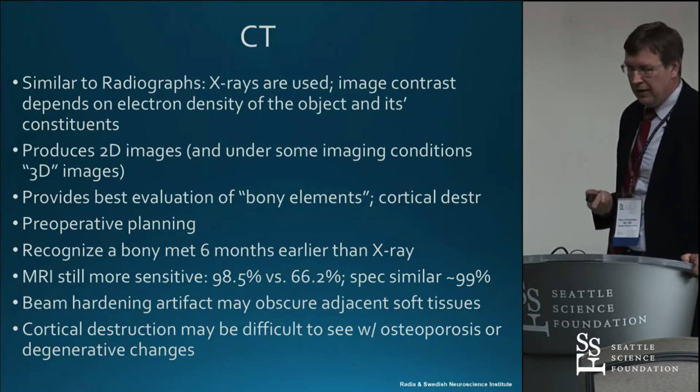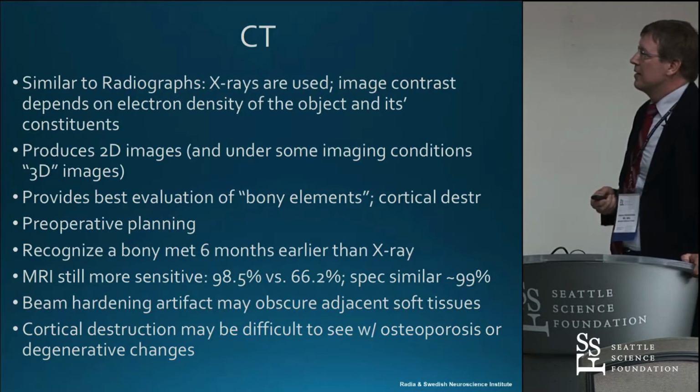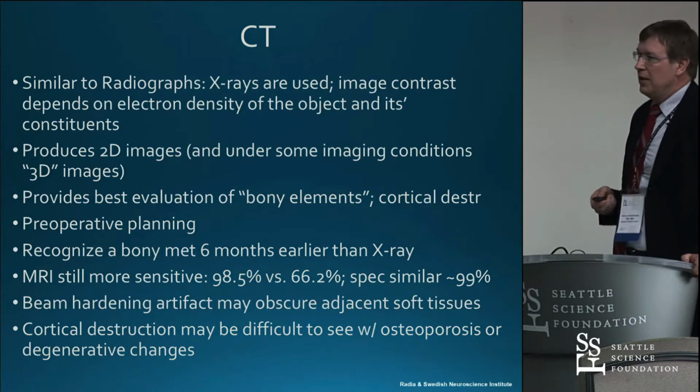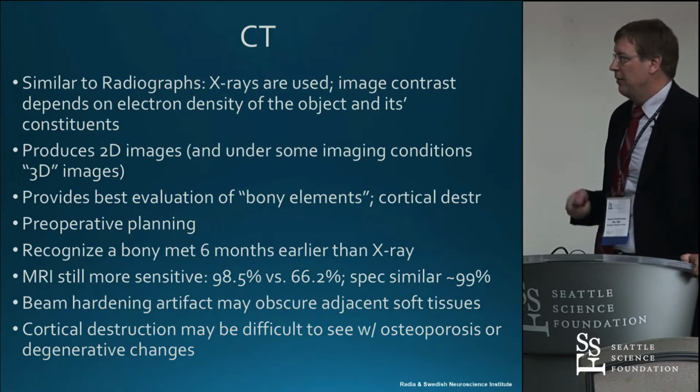CT, of course, technically works similar to radiographs. It's just a stack of radiographs in a sense. We get 2D images, in some cases 3D images. This is really the best study for bony elements, cortical destruction, and preoperative planning.